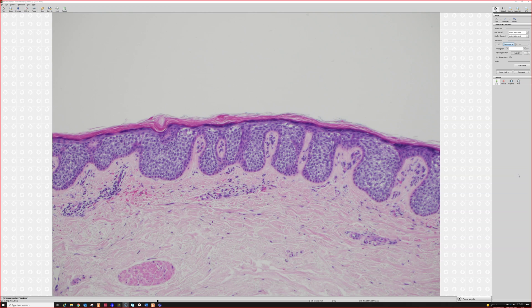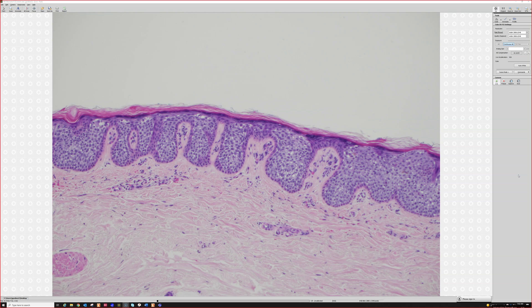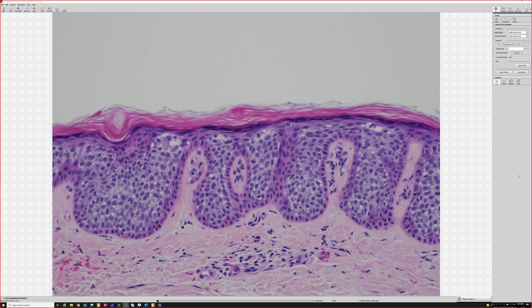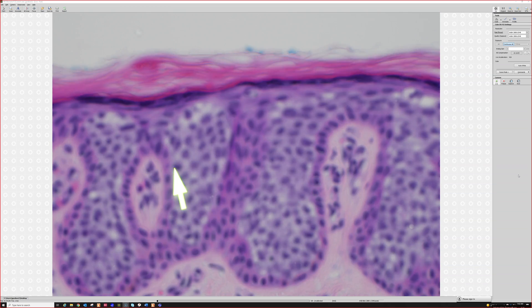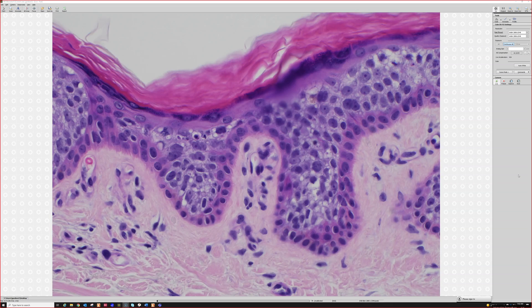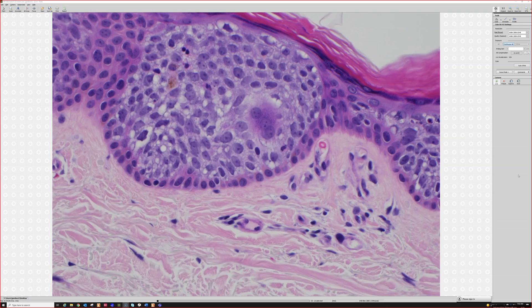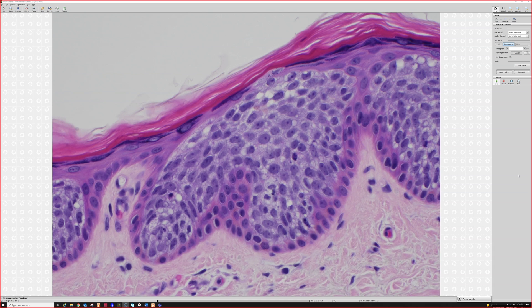Dr. Gardner: Can you throw hydroacanthoma simplex into the differential from low power? Absolutely, thank you for bringing that up. Hydroacanthoma simplex is kind of like intraepidermal poroma — basically uniform, monotonous cells filling up the epidermis without sending fingers down into the dermis. We'll see an example of one later. The real issue is deciding if this is malignant or not, and based on the mitotic activity, degree of atypia, and overall pattern, I think this looks malignant. There are a couple of mitoses right here, and another one there. So squamous cell carcinoma in situ.